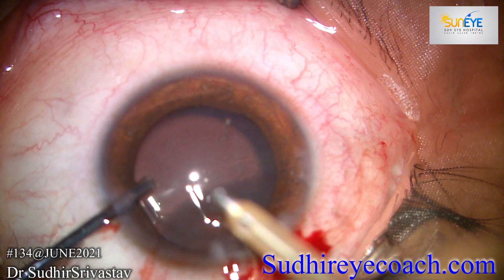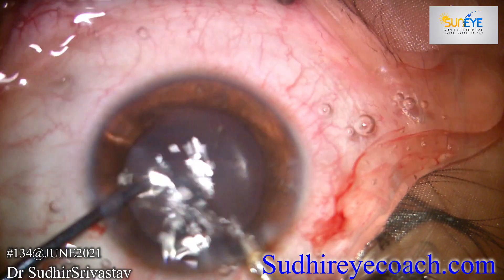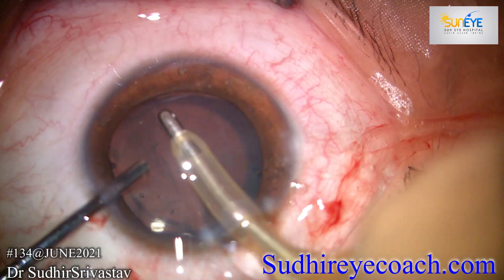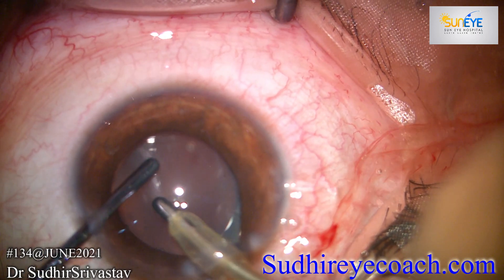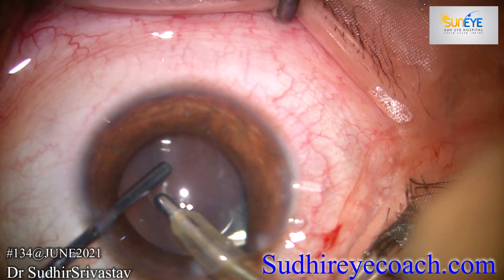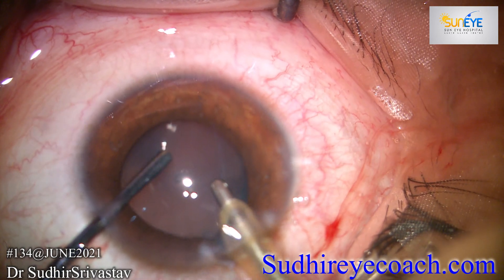For the alignment of the ICL I took the help of a digital marking system, which I am not showing in this video. Thorough viscoelastic removal from the anterior chamber and from behind the ICL is very, very important to maintain low intraocular pressure during the post-operative period.